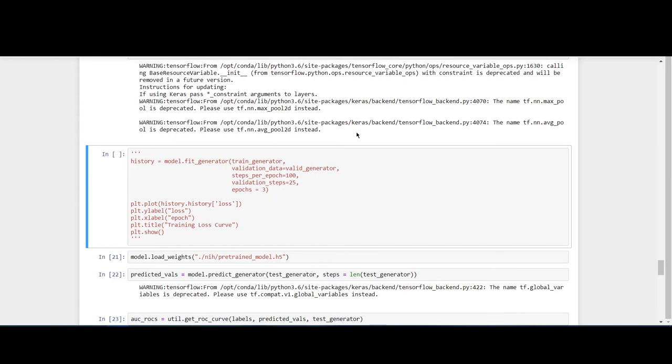Alright, a huge disclaimer: the full data set is 40 GB plus, with 110,000 images. I just randomly took out 1000 images. So if you have a pretty nice machine, or you want to keep your machine on for a few days or hours depending upon your machine, you might uncomment this and run. If you want fewer or more images to train on, you may do so.